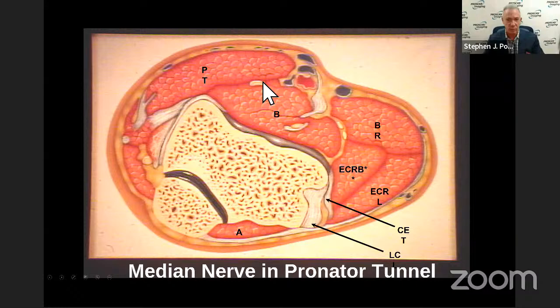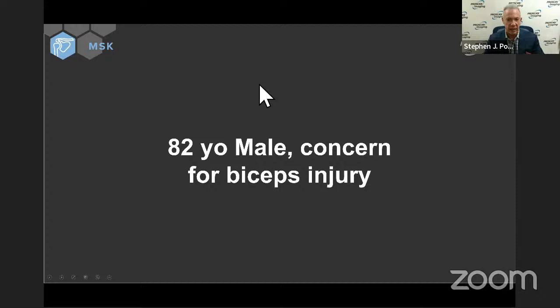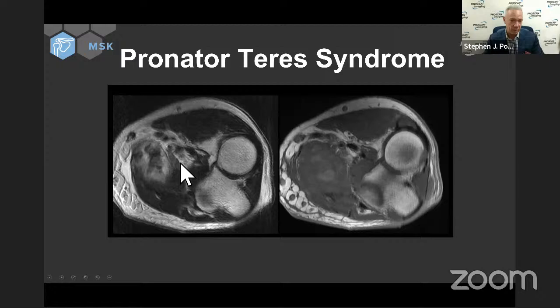Let's have a look at this 82-year-old man concerned for biceps injury. He doesn't have a biceps injury. In fact, the biceps was absolutely fine, but his pronator teres and flexor pronator mass has this large object associated with it that is heterogeneous, has some methemoglobin associated with it. That's an artery right there. We've got some other blood vessels and tendons in the neighborhood, but where's our median nerve? Our median nerve is getting squished right here. Right there is the median nerve.